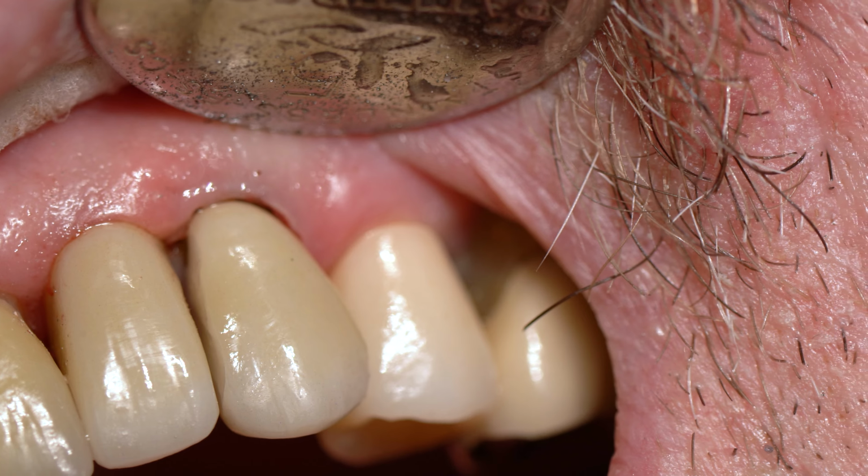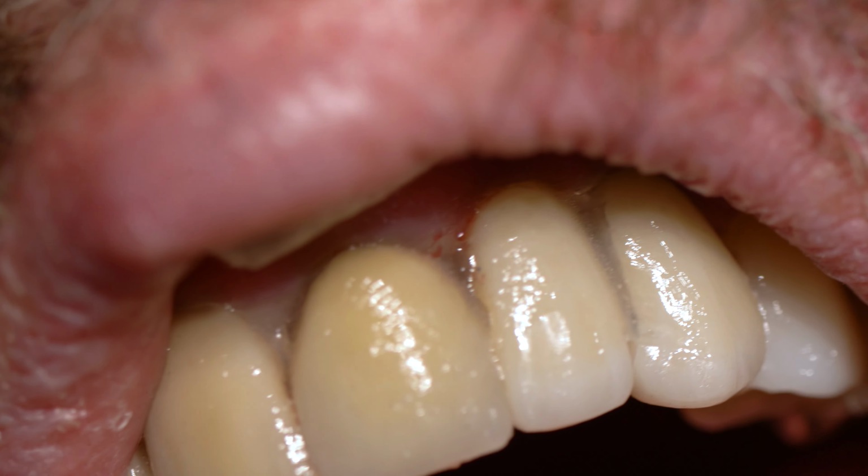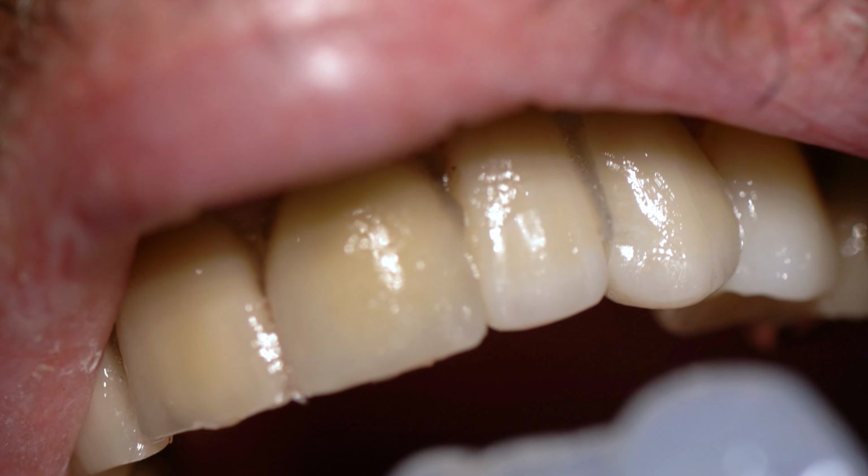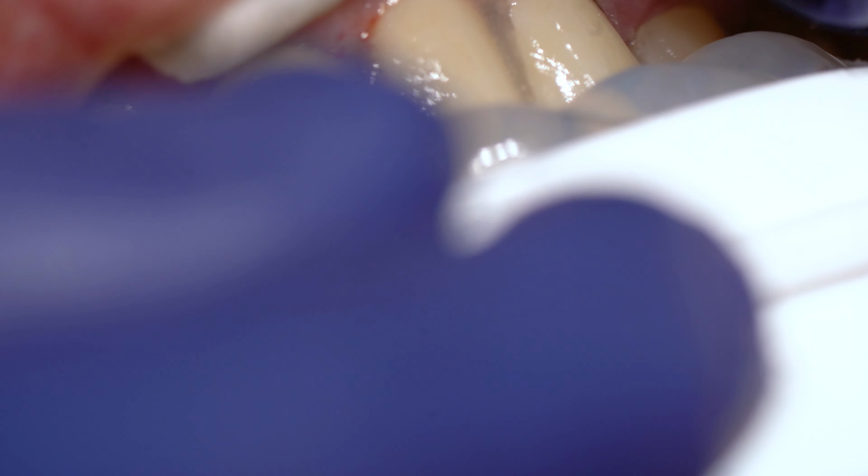I'm going to use this crown basically as a template for my temporary. You could actually just cement this crown. I was planning on just cementing this crown temporarily, but then I adjusted it too much, so now I have to make it temporary. So I'm making a little template for my temporary here, a little matrix. Ideally I could have just adjusted this crown and delivered it as my temporary, but I over-adjusted it. I just blew out the contact and it didn't look great. So I didn't want it looking bad over Thanksgiving break.